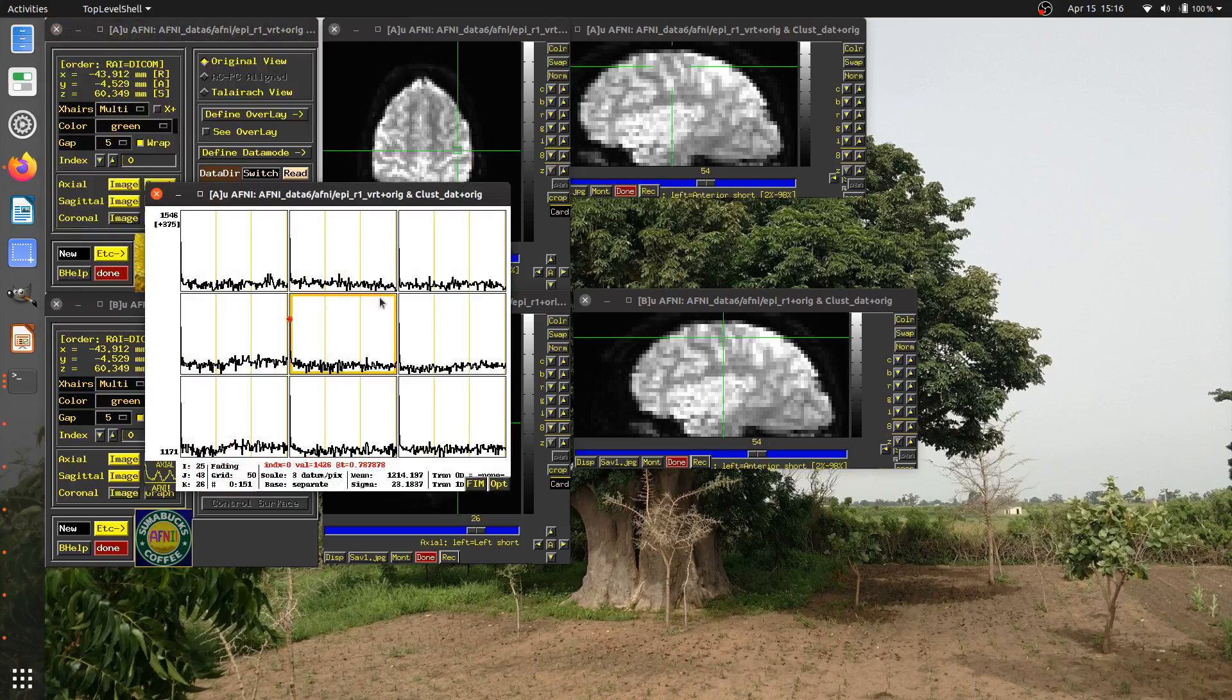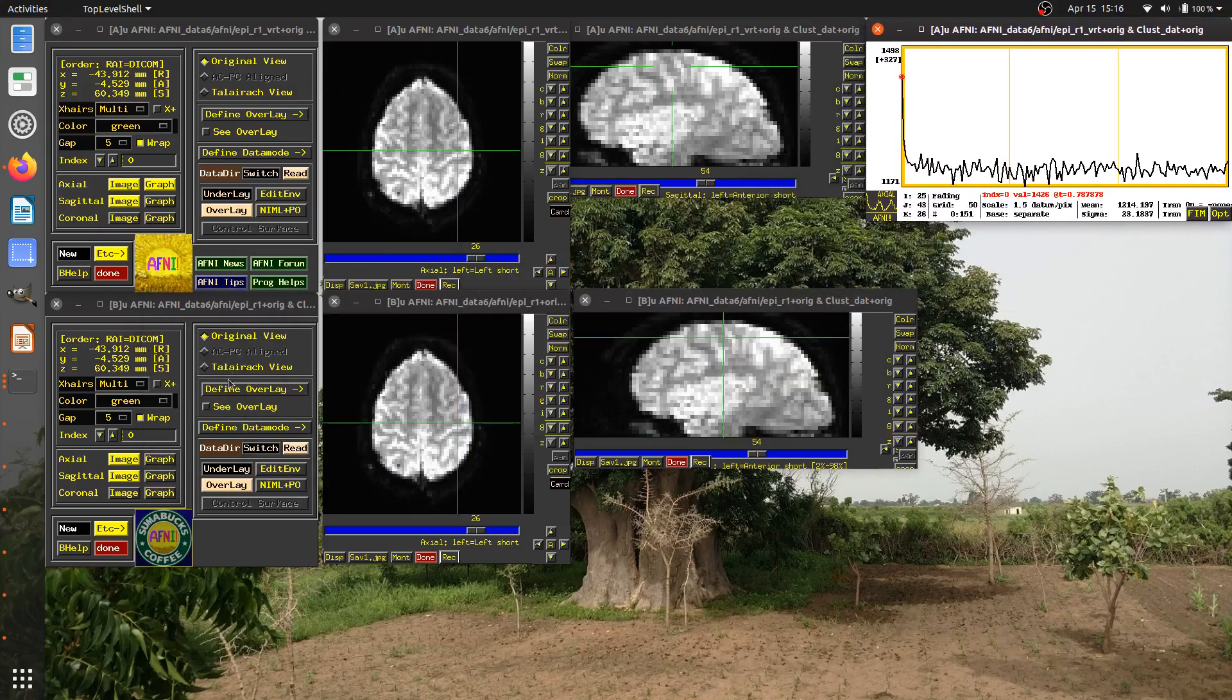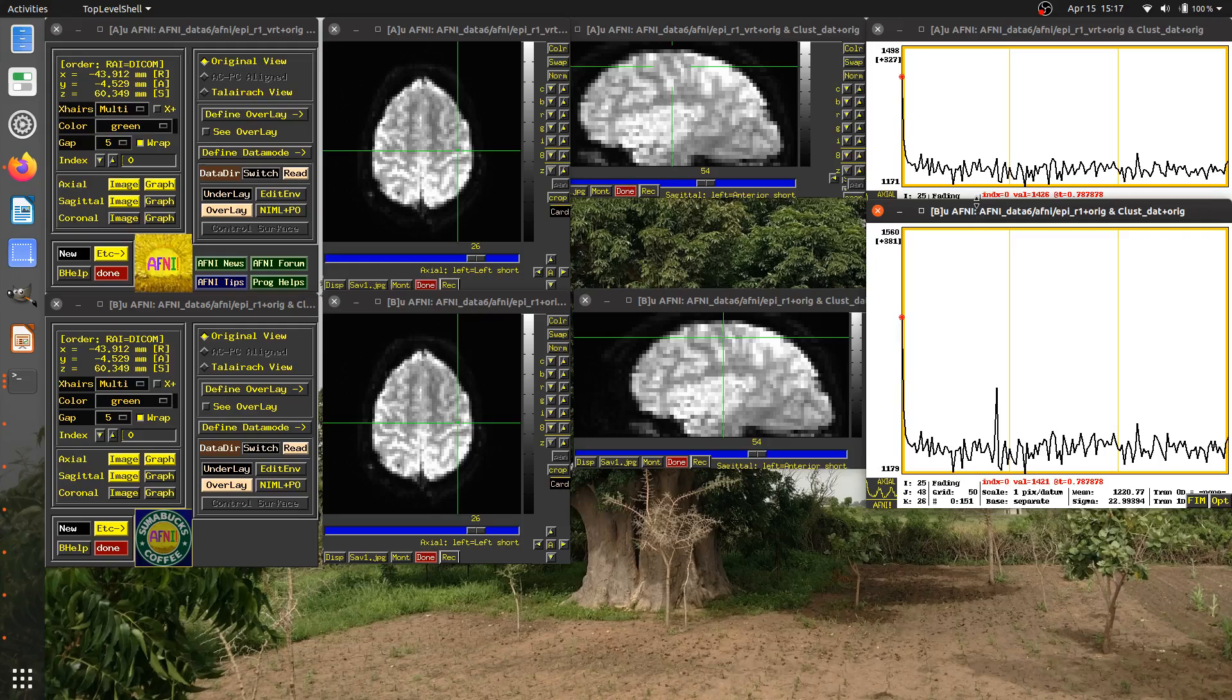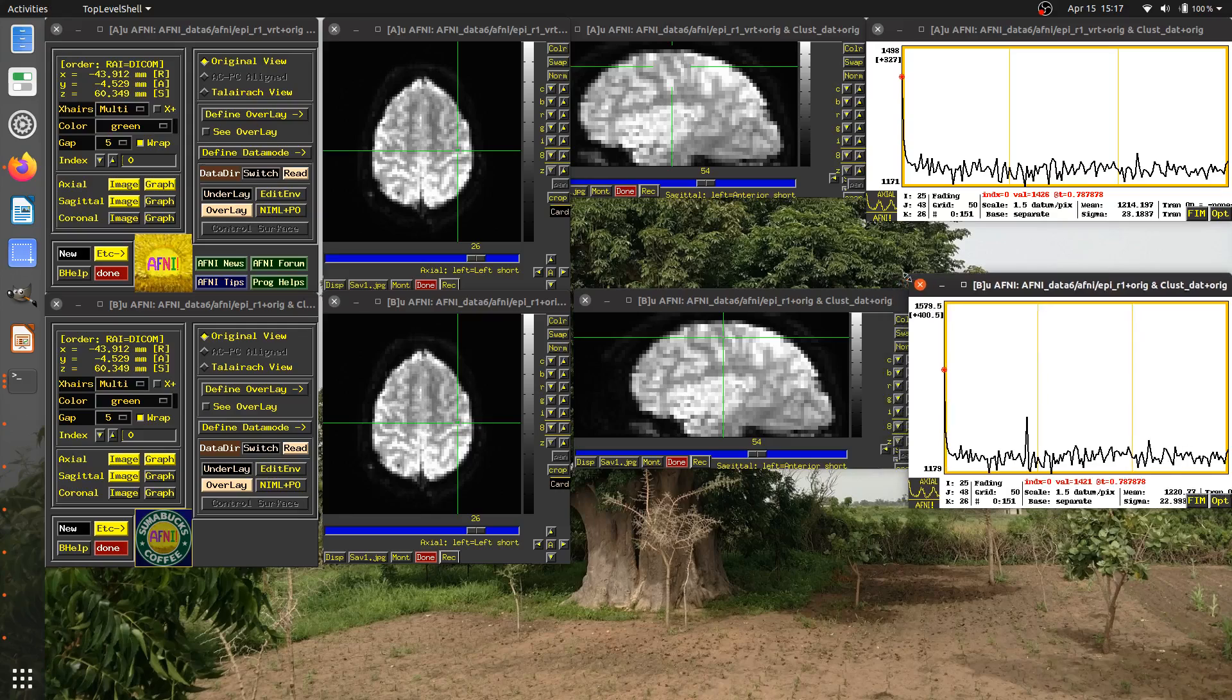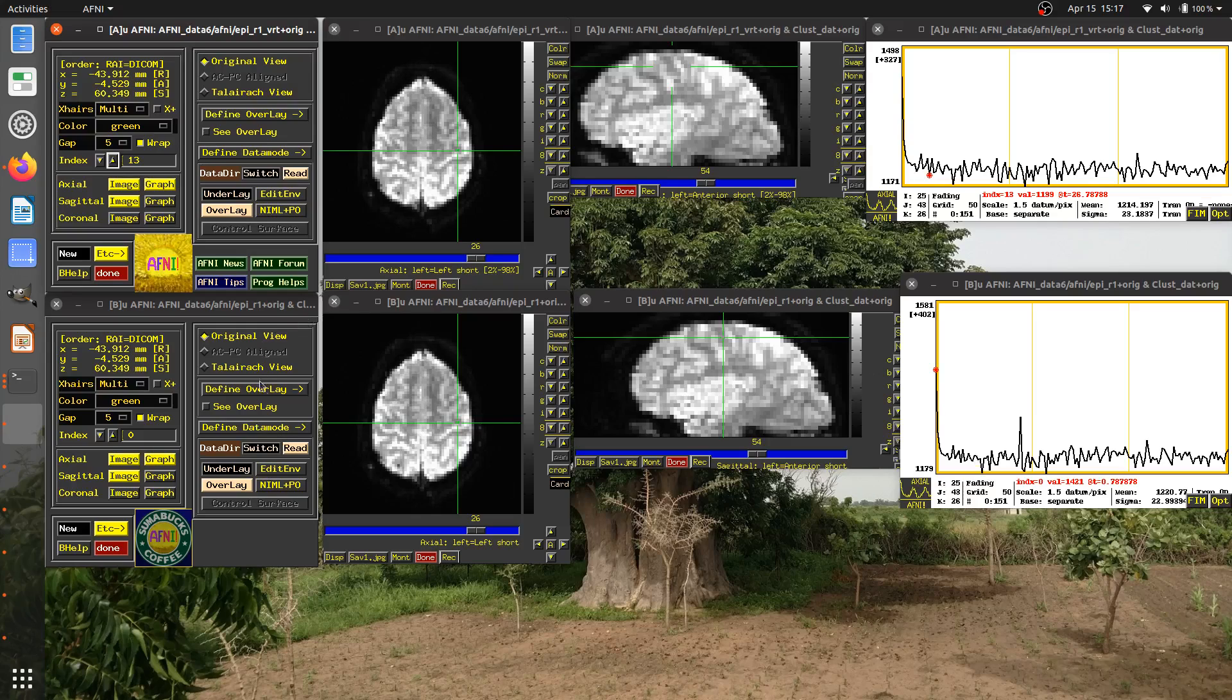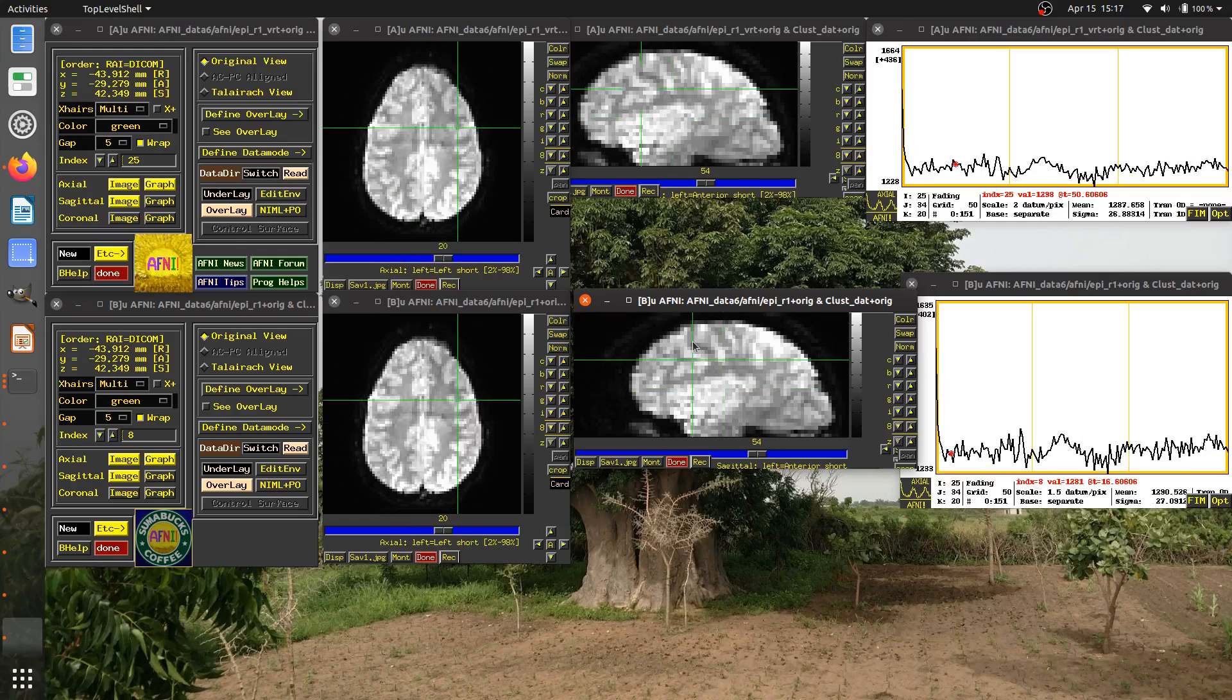And because I have this dataset in time, I can iterate through with the index. I'm going to also just open up a graph window of each one of these. Now I can navigate through time in these datasets in different ways. I could hit the index button here in the A controller, and I see that it's changing visually. And I see here along the time series this red ball that tells me where I am in time. In this data set, though, in this control panel B, it's not keeping up. So these are not time locked.